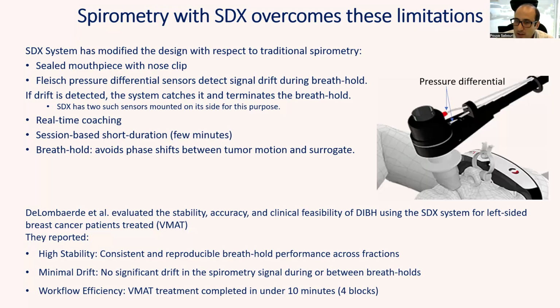There's a Swiss study by de Lombard where they evaluate the use of SDX for DIBH and VMAT breast treatments. They report good stability, no significant drift, and the breath hold blocks could be delivered pretty efficiently. They report within 10 minutes. So while no system is perfect, the SDX does implement a few technical modifications aimed at addressing the limitations that were discussed earlier.